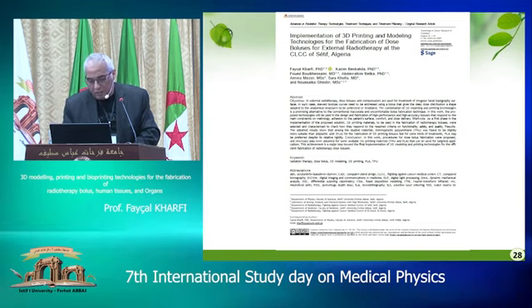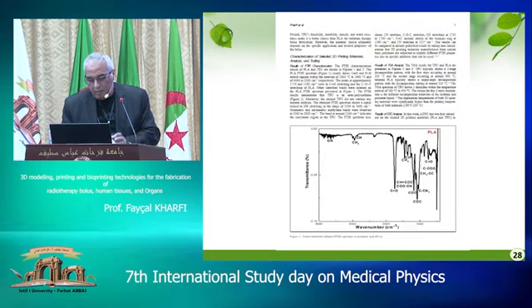So the mechanical property, and the behavior of the material during 3D printing. So we publish in the first phase of our project the characteristics of the material that we are using to print bolus for radiation therapy.